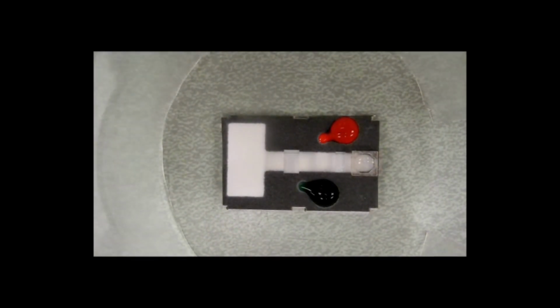This clear fluid begins to flow down the central channel by capillary action. You see that it is well past the test spot, and now the red fluid begins to flow and pass over the test spot. Now the green fluid does it too, and passes over the second spot.